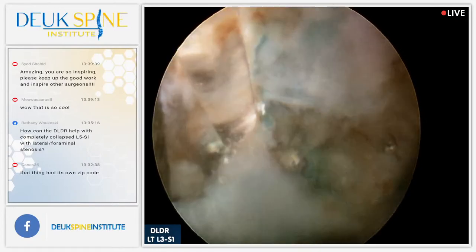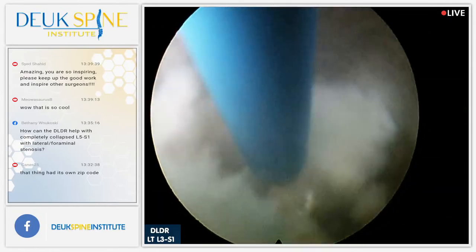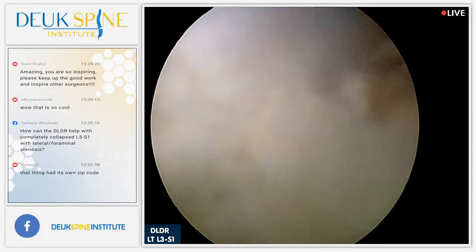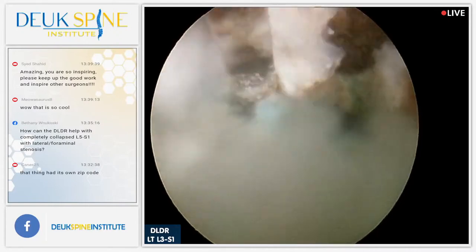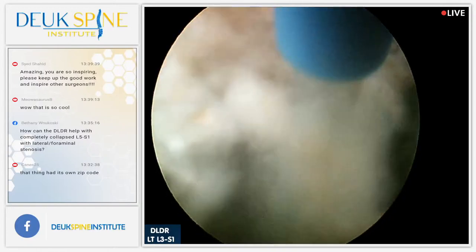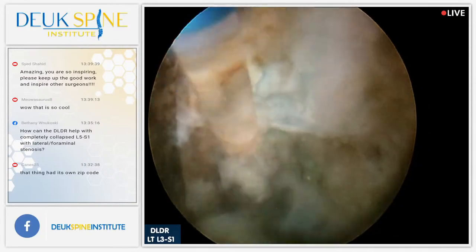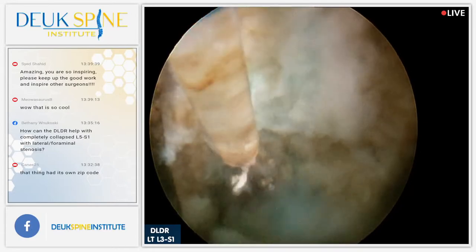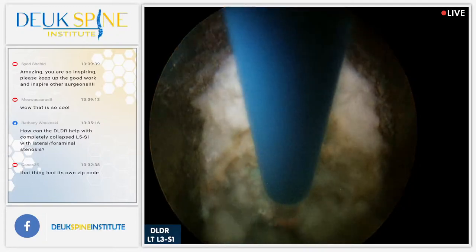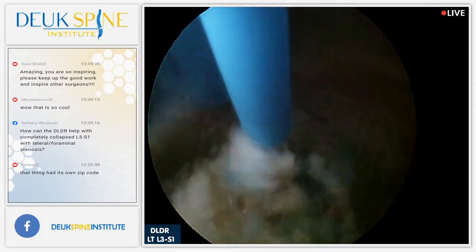It's a good thing we got the big taco today, or I should say the big burrito. So this will be called the big burrito since we're naming everything, Luis. And the other one will be the tiny taco. So this fiber is a 1 millimeter fiber. If you guys watched the cervical that we did this morning, that was a 0.5 millimeter fiber. So this fiber is officially now called the big burrito. And the other one will be the tiny taco. Sorry, I'm just thinking about Mexican food. I have two foods that I love the most, Mexican and Indian.